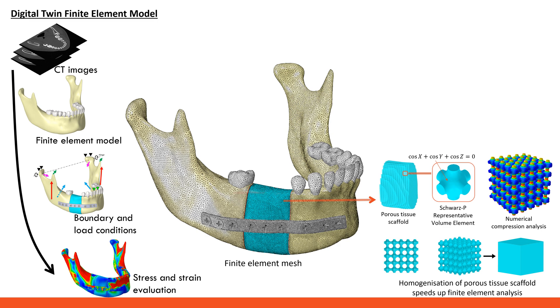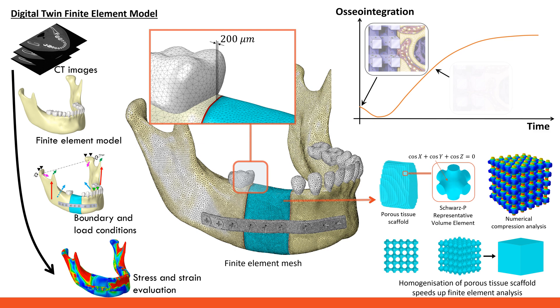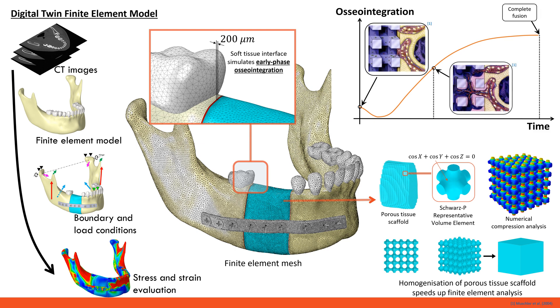The second notable feature of our model is the inclusion of a thin, soft tissue layer between the host bone and each side of the scaffold. This soft tissue layer is representative of early phase osseointegration following implantation of the scaffold, and prior to the substantial ingrowth of bony tissues into the scaffold that occurs later in the osseointegration process. Let's run this finite element model and visualize some of the results.